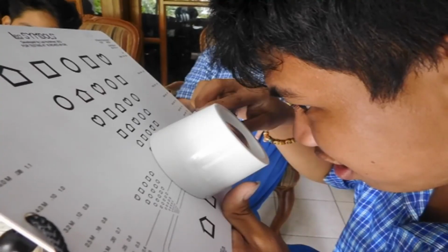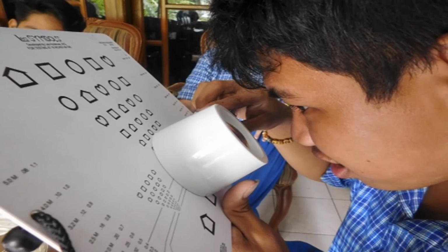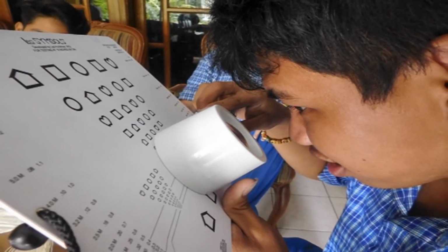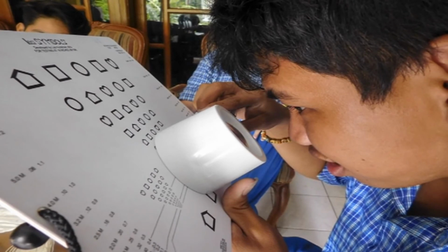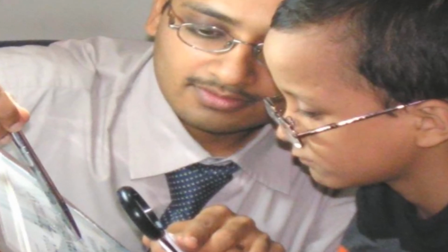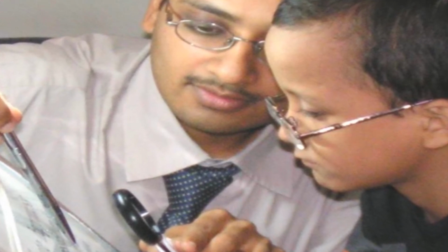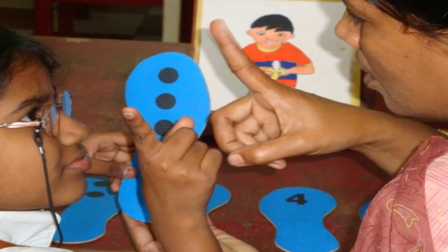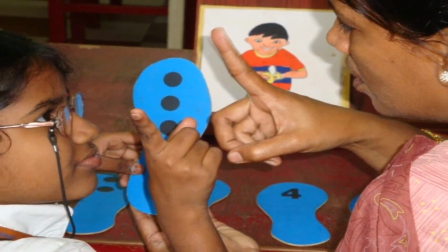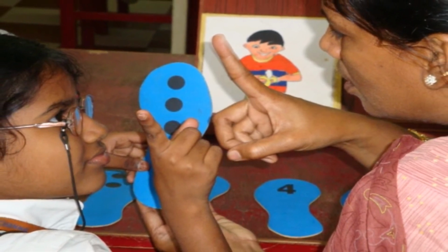Children accept low vision devices more readily than adults and with a higher rate of success. They tend to use more than one device depending on their requirements. Good communication with parents and teachers is important in order to maximize the successful use of low vision devices. Parents and teachers should be encouraged to note difficulties when using low vision devices, especially during the first home trial.